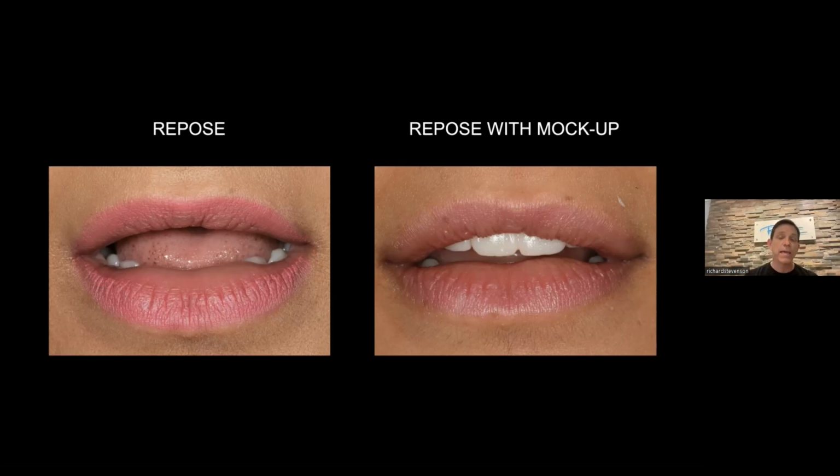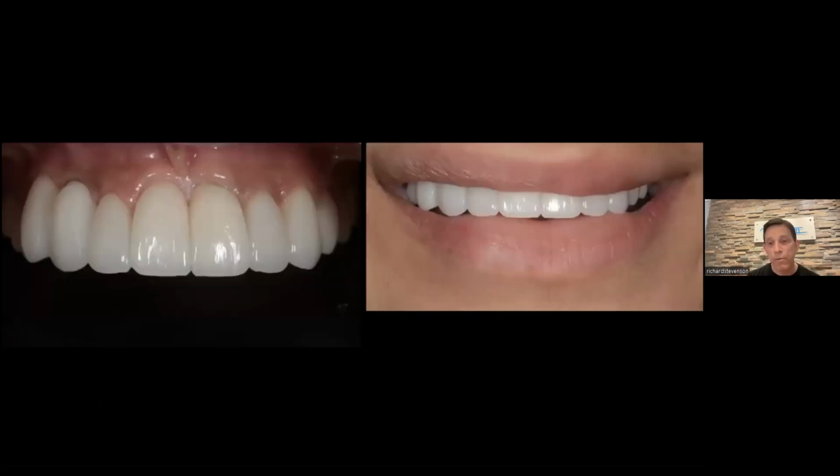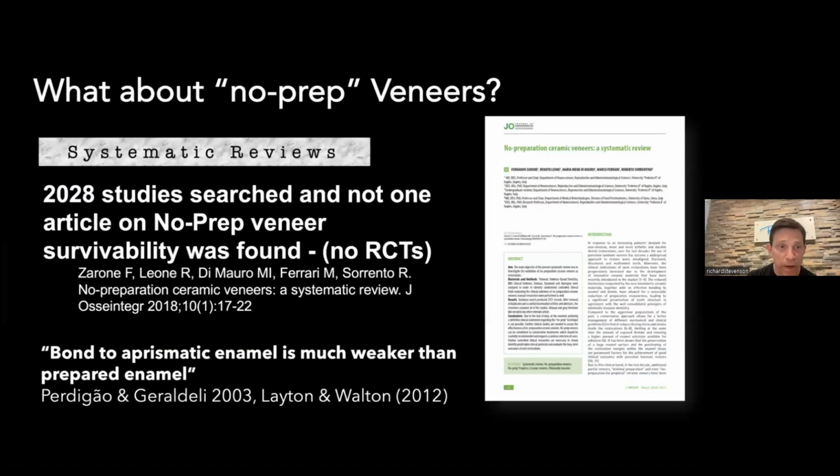So by adding teeth back in like this with this mock-up, we give her a chance to have a nicer looking smile. So although these are kind of strange looking veneers because they're really long, and I brought the veneers back to the premolars and then had to put a crown in that, she has like two canines. Even though the veneers had to be really, really long, they were able to provide her with more of a smile like this. And I wouldn't have picked this shade for me. I think it's probably an OM1 or something. I think it's really, really bright, but it did give her better smile characteristics in her opinion.